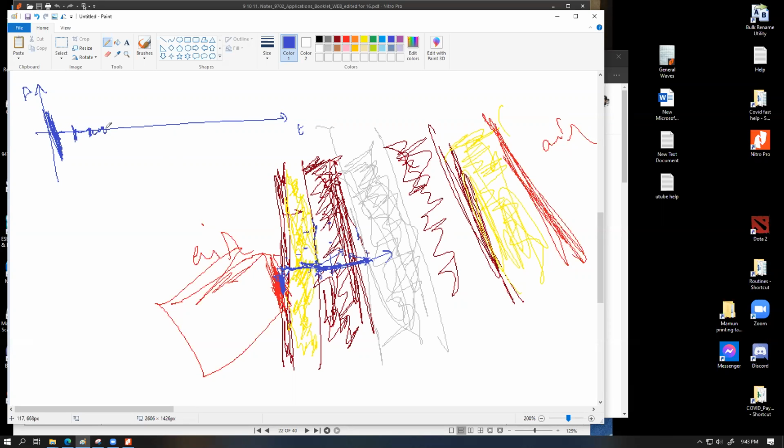And the computer has a way to know the maximum amount of time that it could require for the sound to travel all the way to the bone and eventually come back. Let's say for a certain scenario that duration is 2 seconds, which is not supposed to be 2 seconds ever, but let's say it is. That means within the 2 seconds all the sound will be back at the source, so you can send the next pulse after 2 seconds.